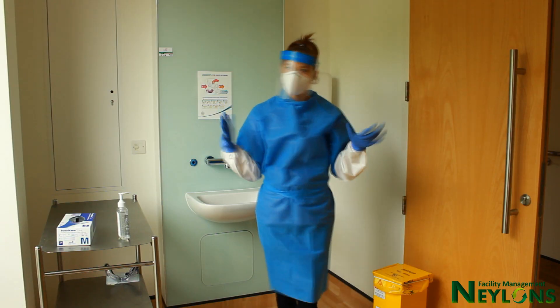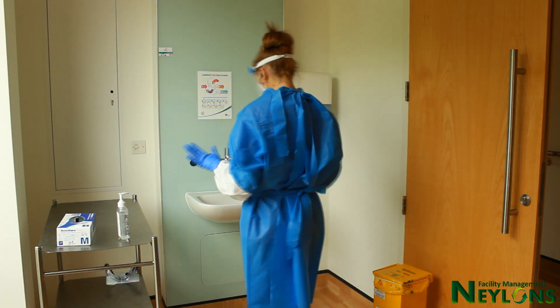If possible, have a buddy to check that your PPE is on correctly before carrying out a task.